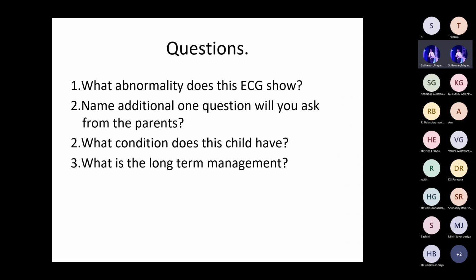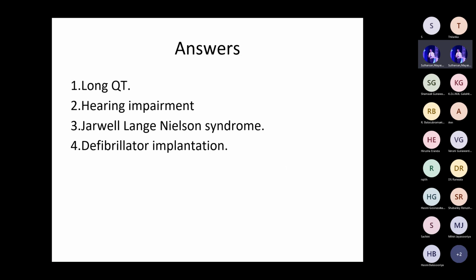Long QT with fainting. Long QT can cause VT and VF. So that's the reason for fainting. So the treatment is the same. Defibrillator implantation and pharmacotherapy, right? Okay. You all got it? Online, guys and girls, online? Got it?